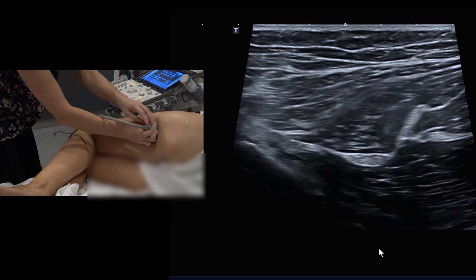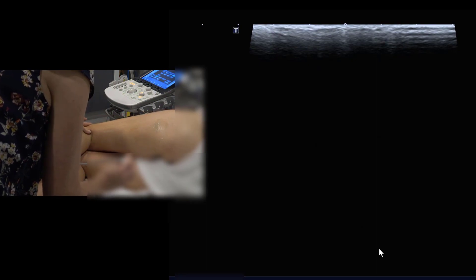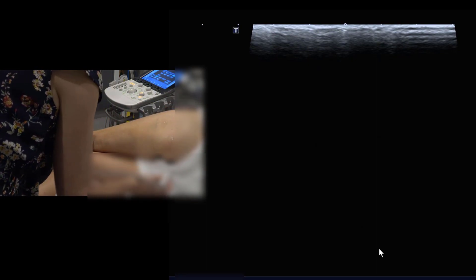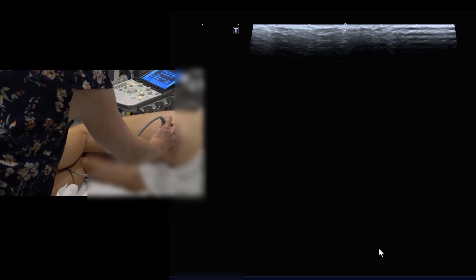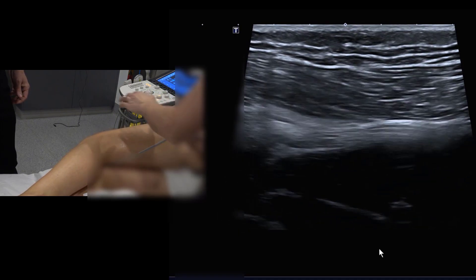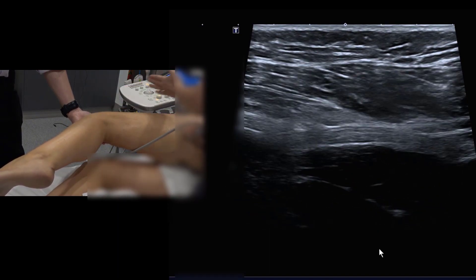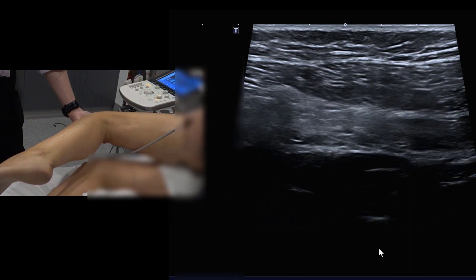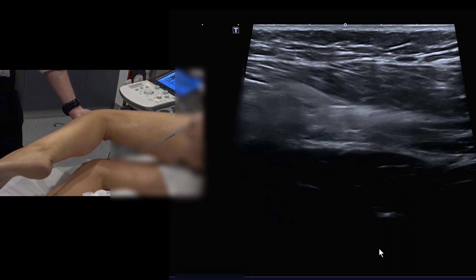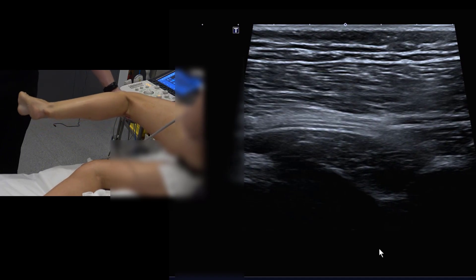An assistant is needed because it's important the movement is partly passive and the knee should not adduct too far towards the table — if the knee falls toward the table it creates internal rotation on the hip, which can change the shape of the sciatic nerve. We scan longitudinally. Support the knee to prevent adduction, aim for close to 90 degrees hip flexion — 70 degrees is also acceptable — then dorsiflex the foot and extend the lower leg.